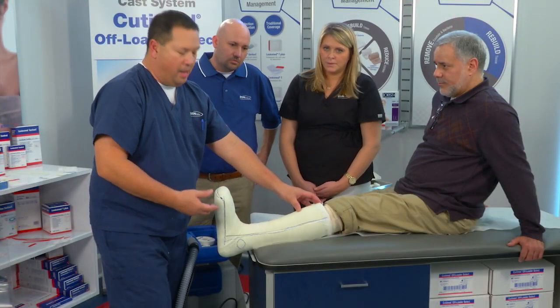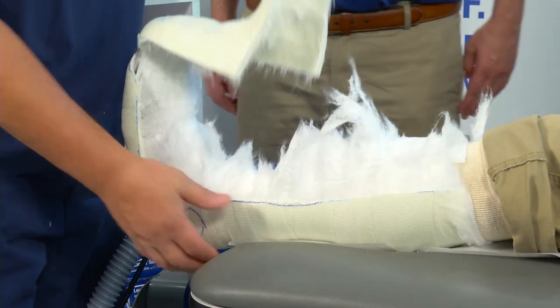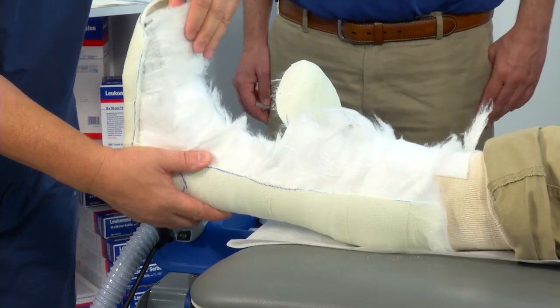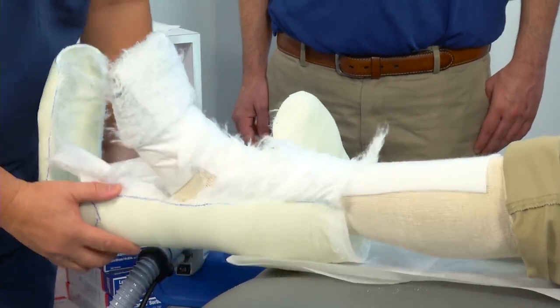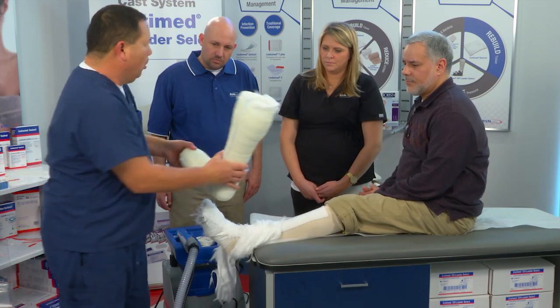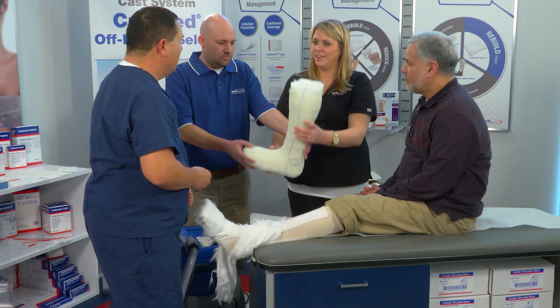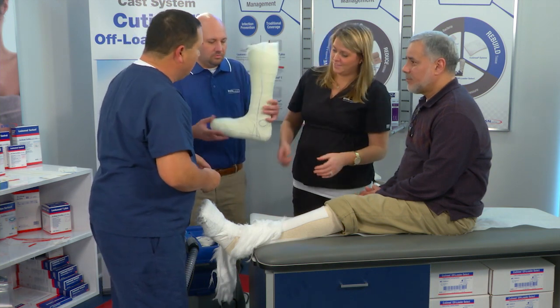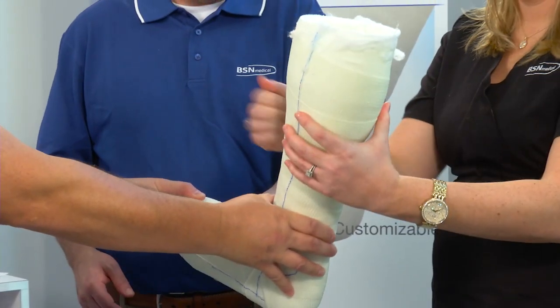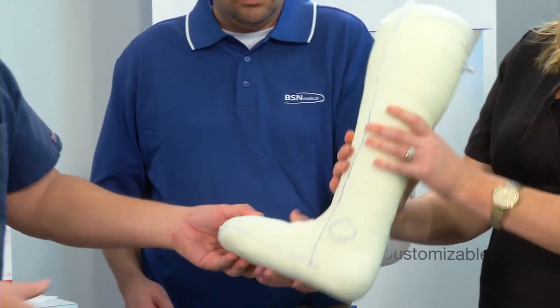Once I have the cast cuts, I just pull and remove the cast just like that. One of the things I like to have them do is hold that with two hands — very light! Squeeze it. It's not very flexible — the rigidity and the light weight are bonuses that your competition doesn't have.